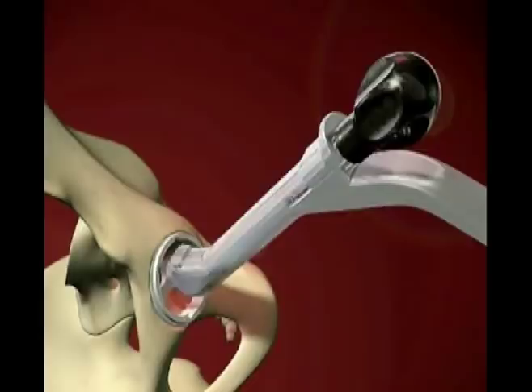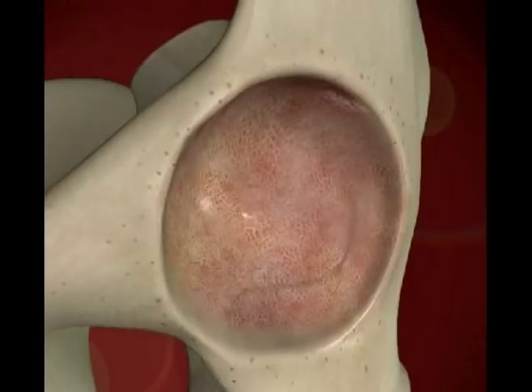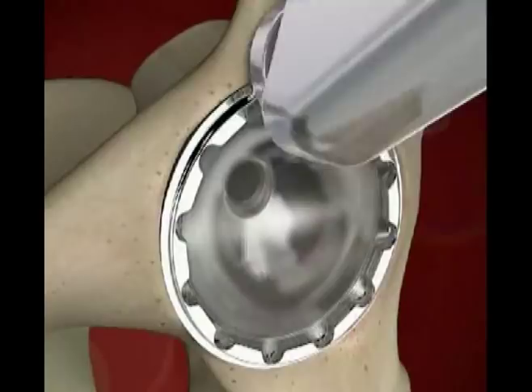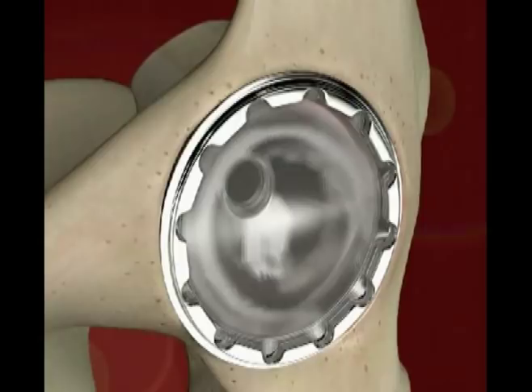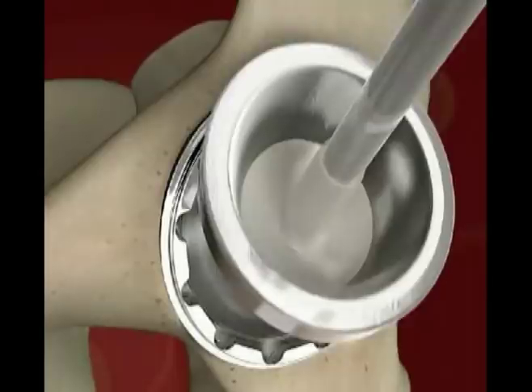The definitive acetabular shell is attached to the threaded connector of the acetabular inserter. The shell is introduced into the acetabulum and impacted in place. Remove all soft tissue from the face of the shell so as not to impede liner seating. Prior to inserting the final acetabular liner, thoroughly irrigate and clean the shell. Select the correct sized liner inserter head and attach it to the acetabular inserter. Final impaction into the shell is completed using the acetabular inserter and the correct sized liner inserter head.